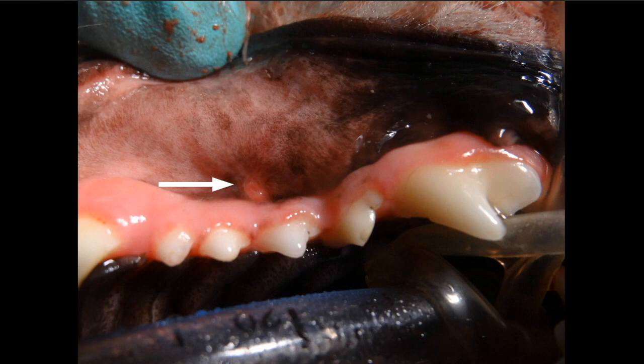So when you have something like that that's in the unattached gingiva, like you have here, which is above that line of demarcation that you see at the butt of that arrow, you see that line there that kind of continues on. You've got pigment in the unattached gingiva, you've got the lesion in the unattached gingiva, and then in the attached gingiva toward the crown, you don't have any pigment. That is the line of demarcation in this particular patient. So anything that is toward the root tip, away from that line or in the unattached gingiva, is an indication, not always the case, but a good indication that the tooth or teeth adjacent to that area are possibly non-vital.